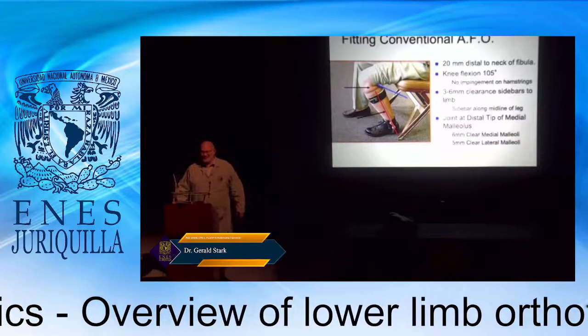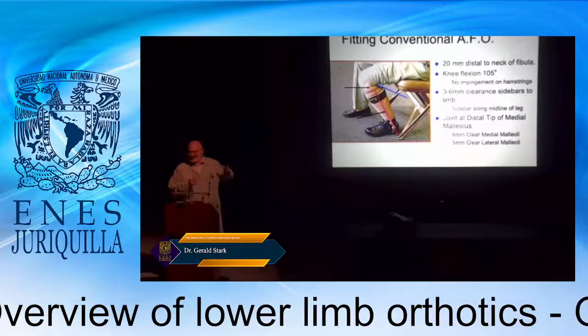Yeah, maybe I shouldn't have told it, but that's why it's so important to make sure that your AFOs fit.